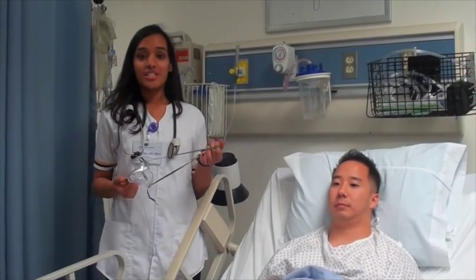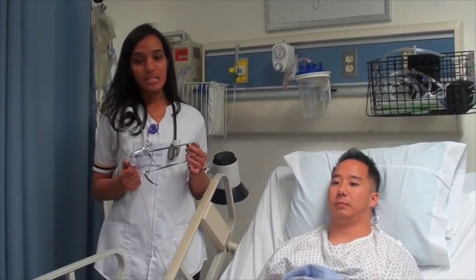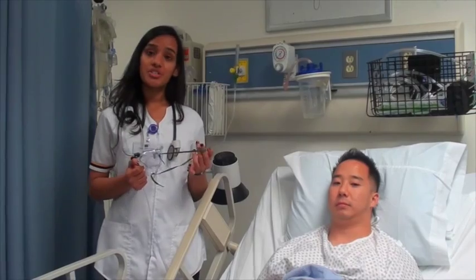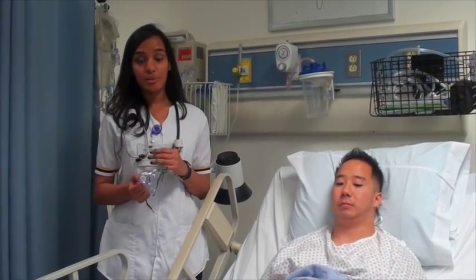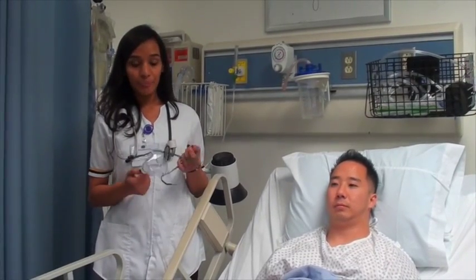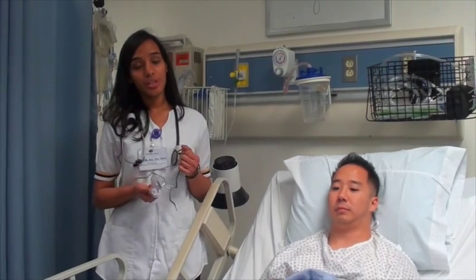Hi, Josh. So the second option is the simple face mask. It is a low-flow delivery device that delivers oxygen concentrations of 35 to 50% at flow rates of 6 to 12 liters per minute. It should not be used for flow rates less than 6 liters per minute to prevent rebreathing of carbon dioxide. It is used for short-term therapy, such as when transporting patients.